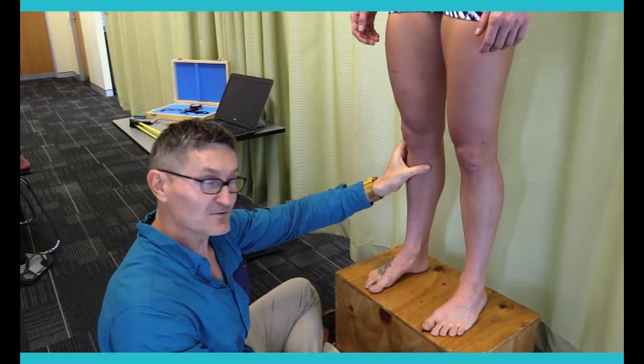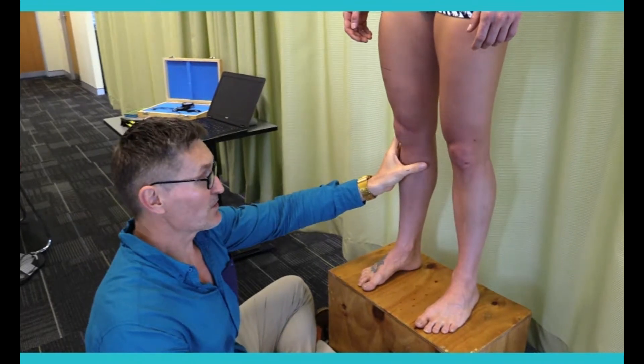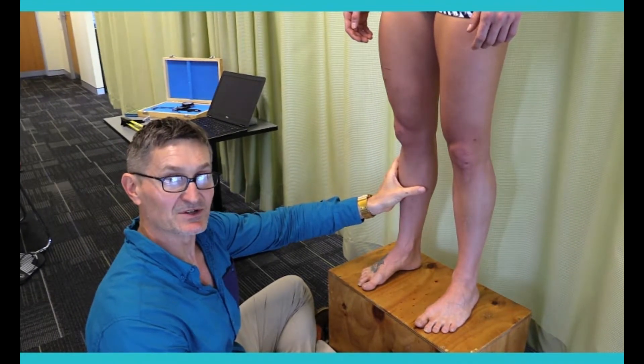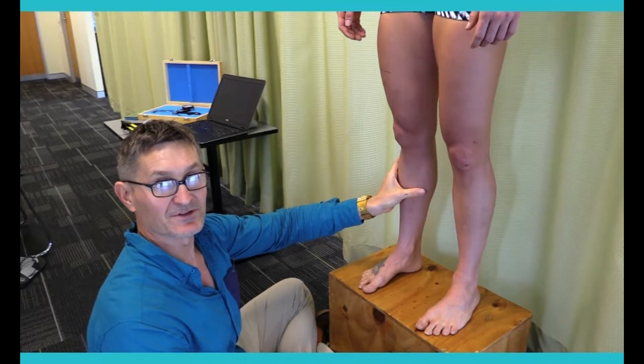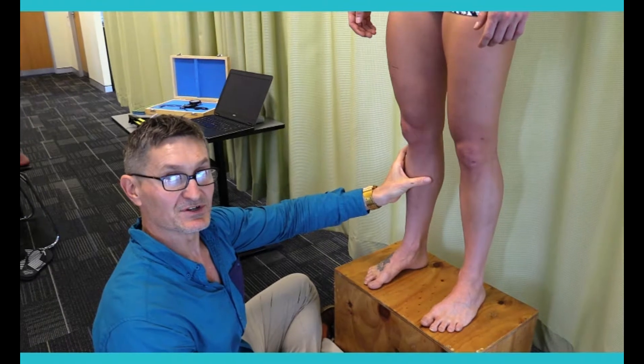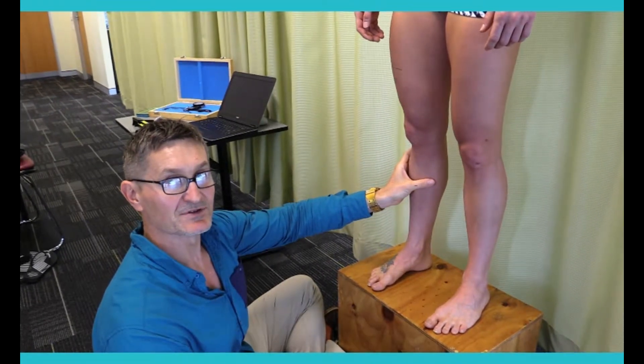So from a technical perspective, we're going to start proximally and we'll work distally, maybe a centimeter at a time until we go past what is clearly the greatest circumference of the calf. We'll work up a little bit more proximally, say a couple of millimeters at a time until we identify that true maximum circumference.